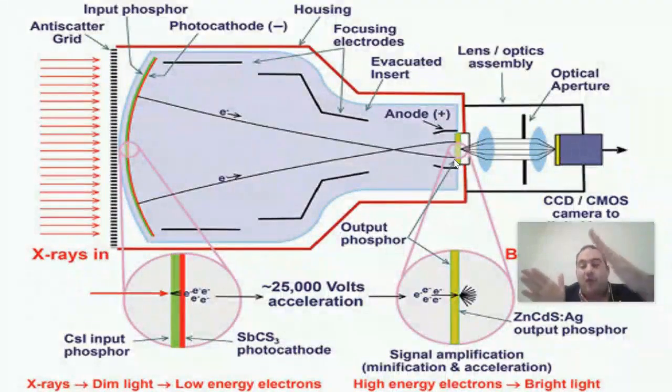Now you are gathering 1000 electrons in a small area, but I will gather 100,000 electrons in the same area. Each electron gives you a signal, providing a signal next to it, while another electron brings another signal from a different location.